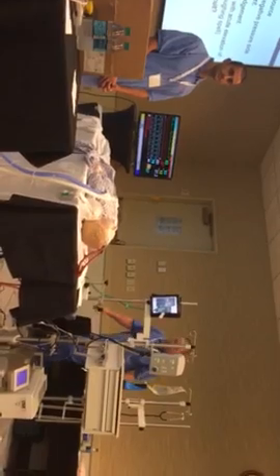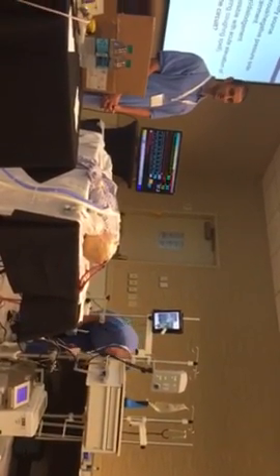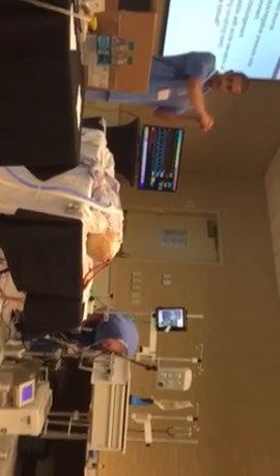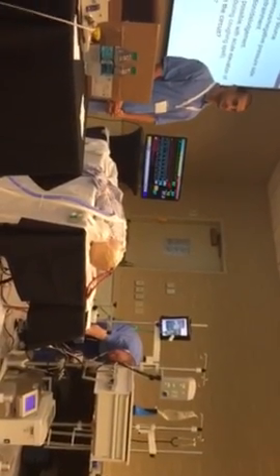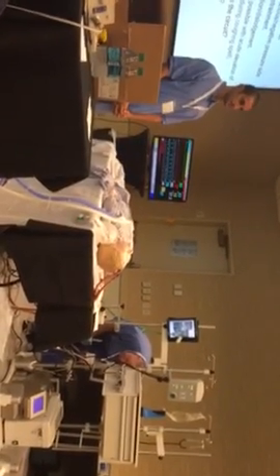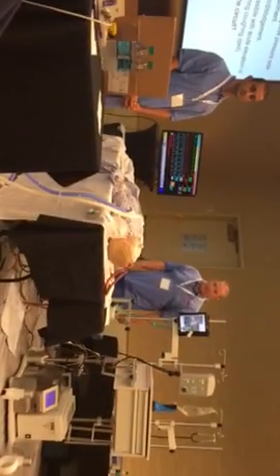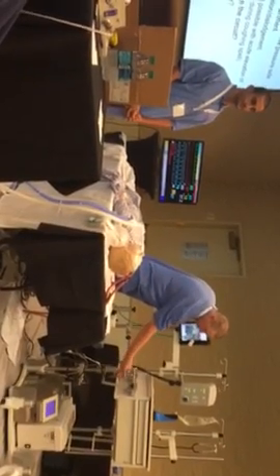What I can tell you is we probably gave 180 to 240 mLs of air. Huge. But we were slowly giving it. And so although on your end it's not appreciated as that volume, what was happening was portions of it were going through to the oxygenator and de-airing, while portions were still remaining in the cone. But the point is both the cone is pretty good at venting air and trying to push it through unless it gets to be too much, and the oxygenator is also pretty good at continually venting.